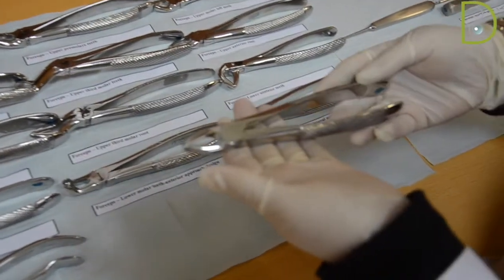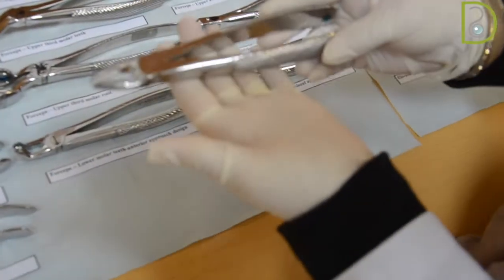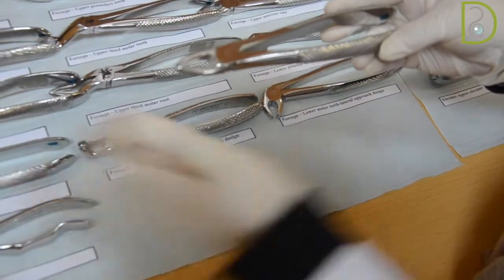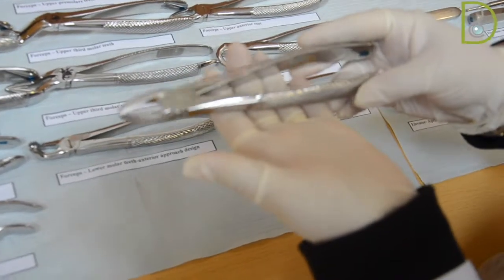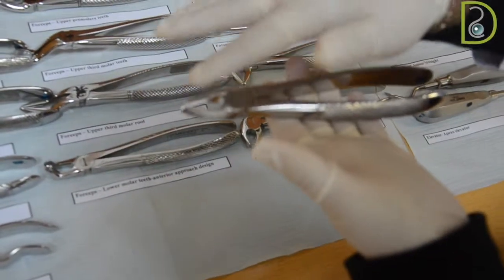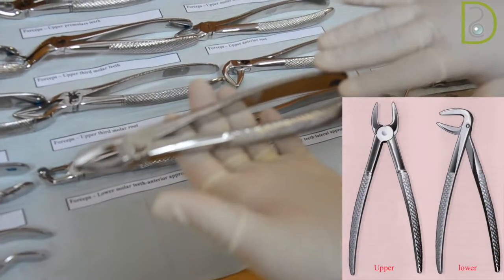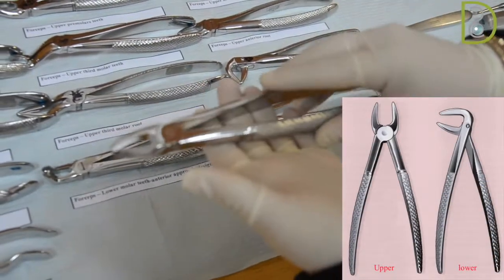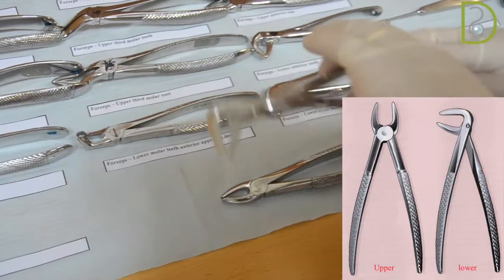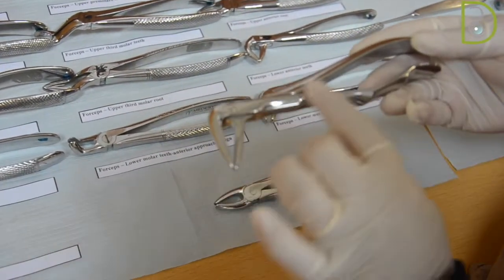Now we will start to differentiate between an upper and a lower forceps. As for the upper forceps, most of the time when you look at them, you will find that the beaks are in parallel with the handles, while for the lower forceps, the beaks are perpendicular to the handle.